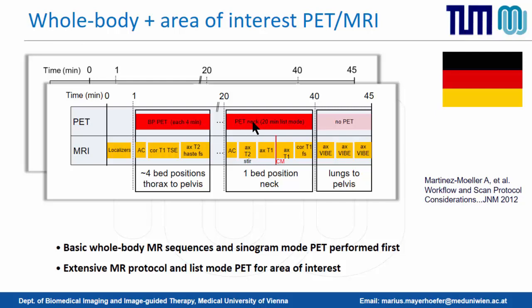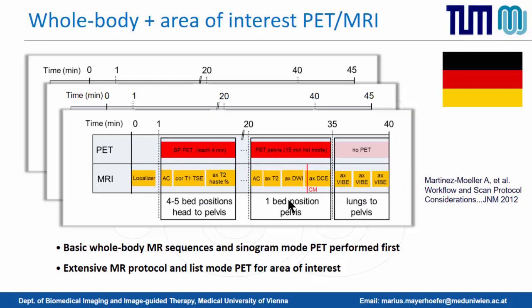The same in the head and neck, just with another set of sequences, no DWI here because there may be artifacts, but basically the same idea, and the same in the pelvis, slightly different protocol, but apart from that, the same mode.